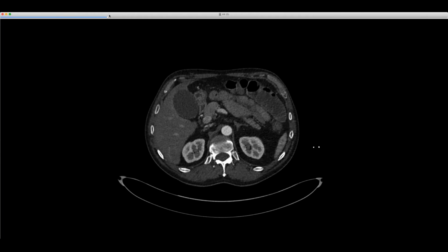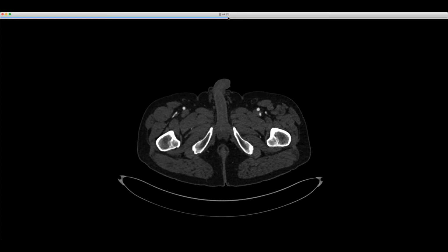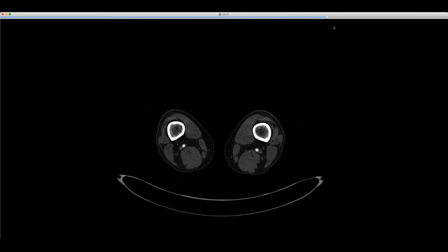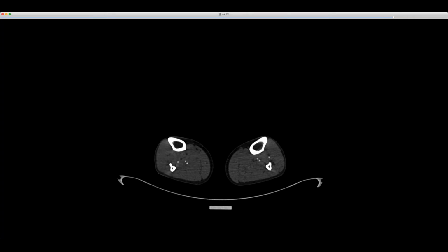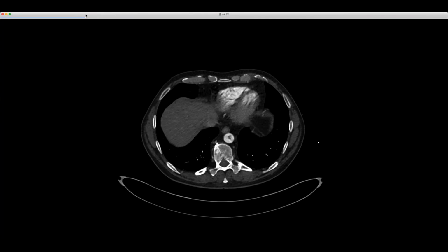And then, obviously, you want to look for embolic phenomena. This patient came in with leg pain, and you can guess where this is going. You can see the profunda right here is occluded, so that's one embolus this patient had. Then go down to the lower extremities, and you can see that the anterior tibial and the posterior tibial both abruptly terminate right here. You can't even see the anterior tibial that terminated earlier. So this is a really nice example of a free-floating aortic thrombus causing embolic phenomena.